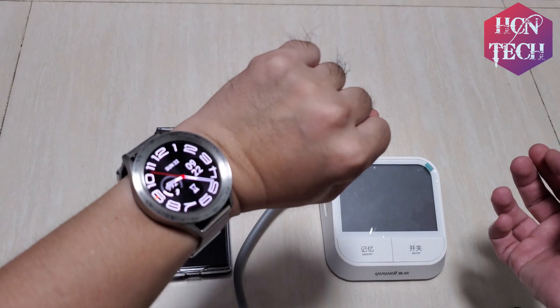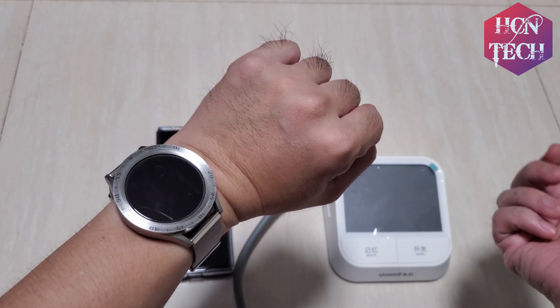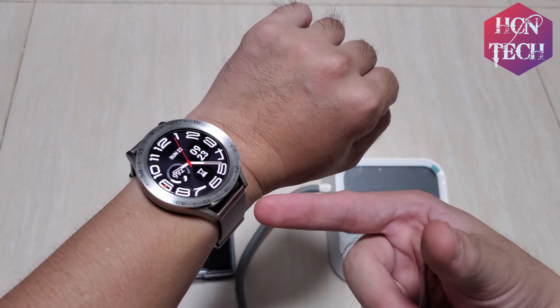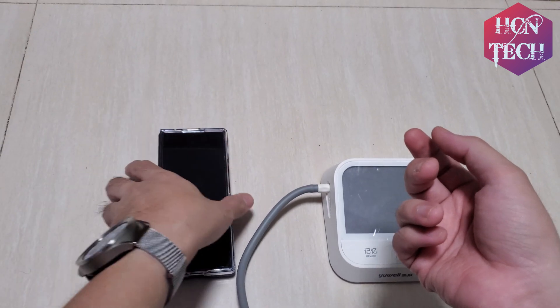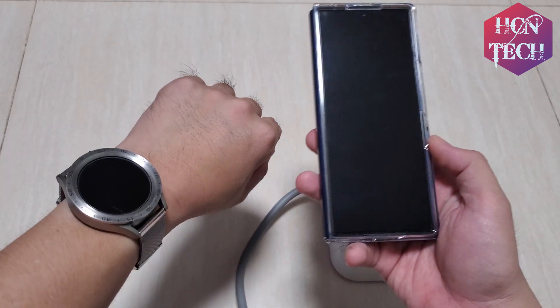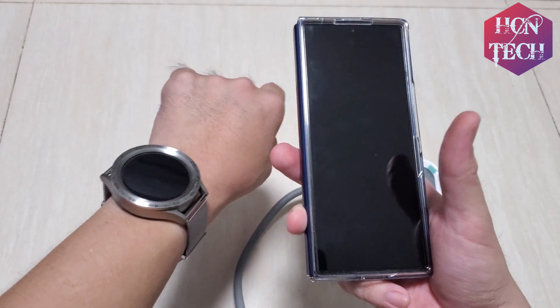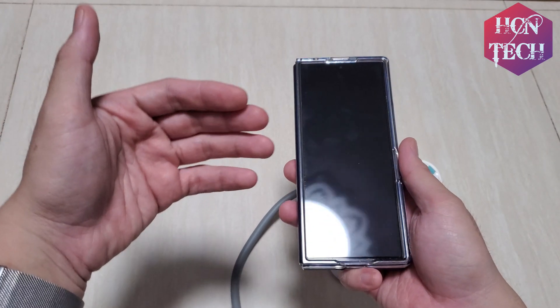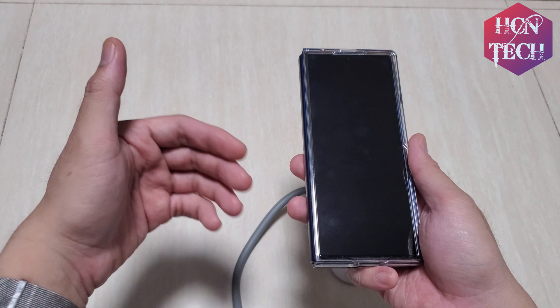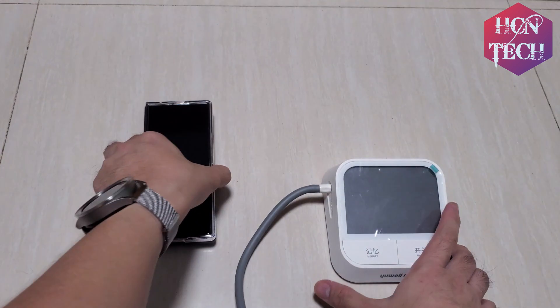Today I want to show you how to measure blood pressure on your Samsung Galaxy Watch. First you need your Samsung Galaxy Watch — in my case this is the Watch 5 Pro — connected with my Galaxy Z Fold 4. You have to install Samsung Health Monitor both on your smartphone and your smartwatch. If you live in a country where the blood pressure monitor is not supported, you have to install the modded version that I already covered in my previous video.